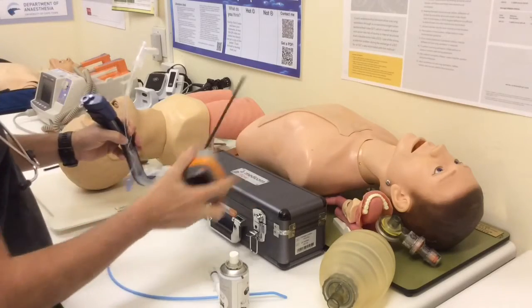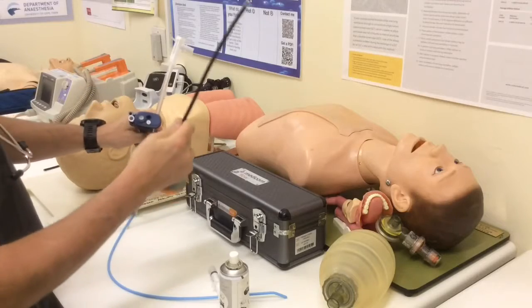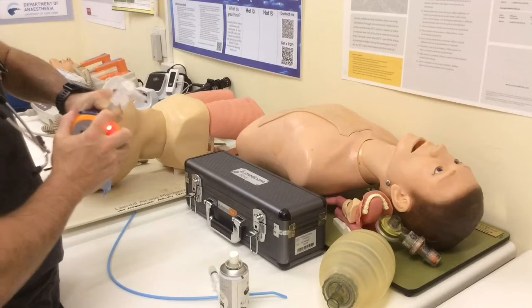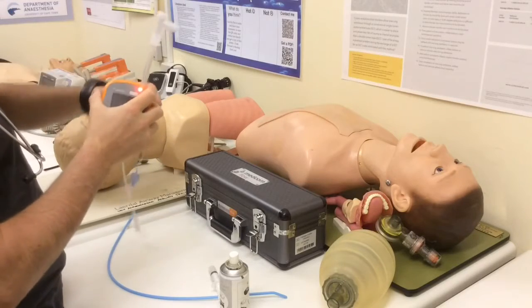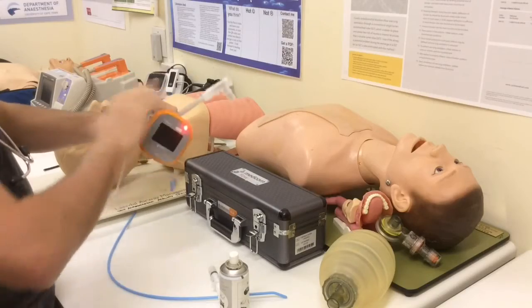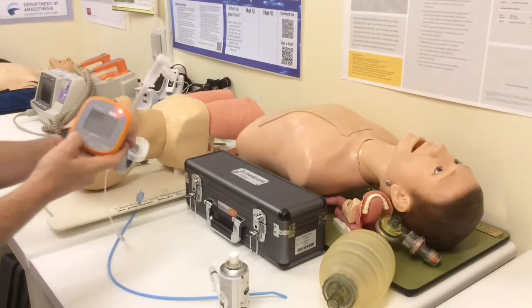We need to load the camera so we can see. Now, the camera stalk fits down a channel inside the disposable, and it's completely isolated from contact with the patient. So the camera doesn't need to be re-sterilized, etc. It's kept completely clean. It can obviously be wiped down if you're getting secretions and so forth on it.